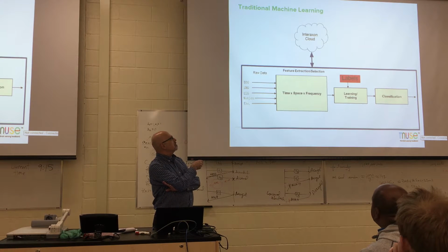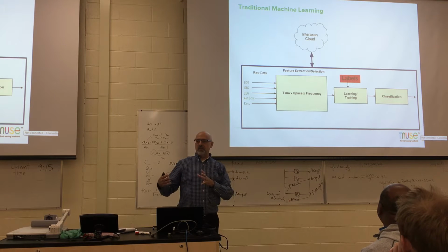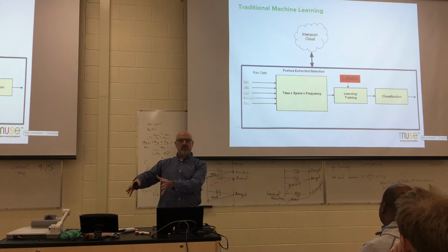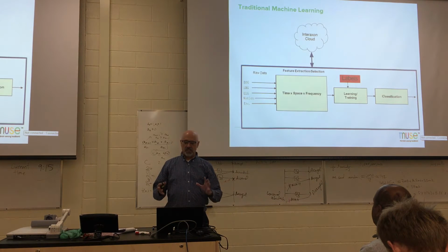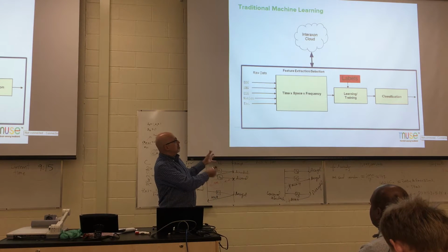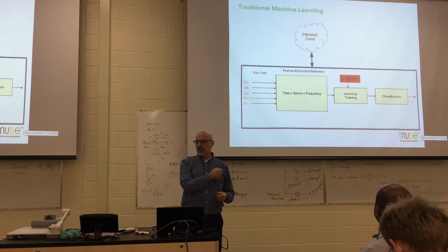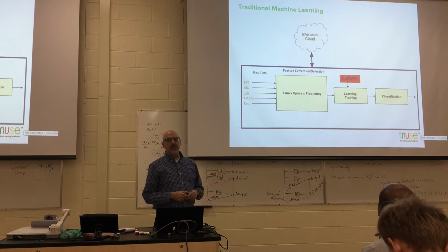And what I mean by traditional machine learning is that you need a domain expert that understands what these signals mean and can identify them by eye, and help find a whole bunch of segments of labeled data to tell the classifier, yes, this is a segment of eye movement, and this is a segment of clean data. And that labeling process allows the statistics to categorize all of the features or the variables that have been measured to train a classifier. This is a quick introduction, so I'm going to get into a little more detail, especially on these two parts and a little bit on the learning and training.